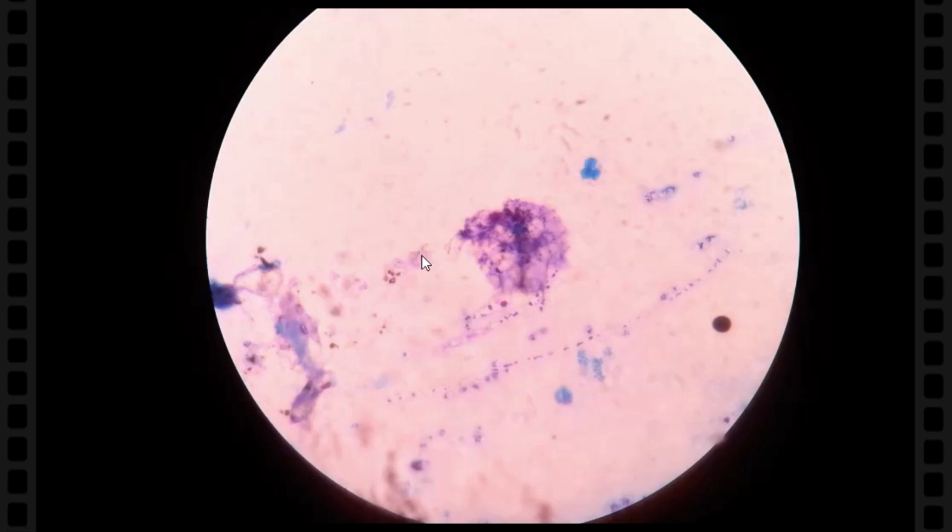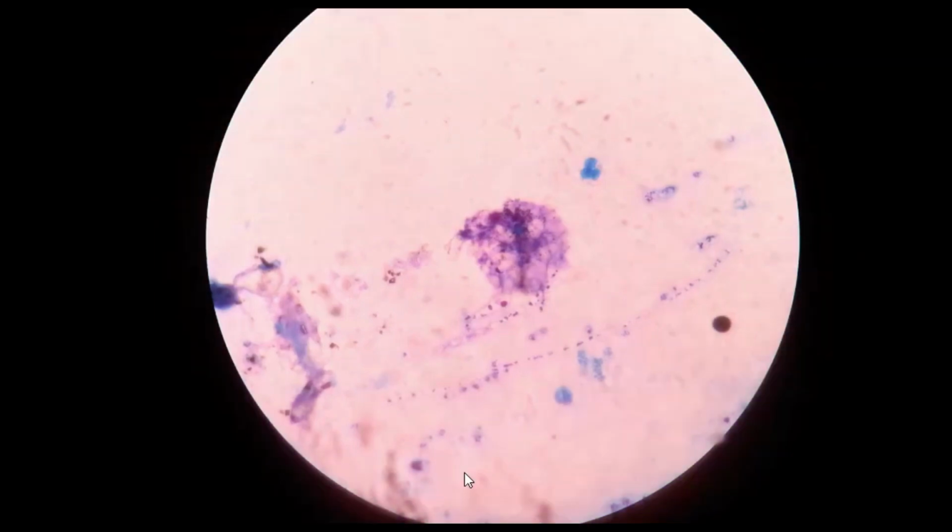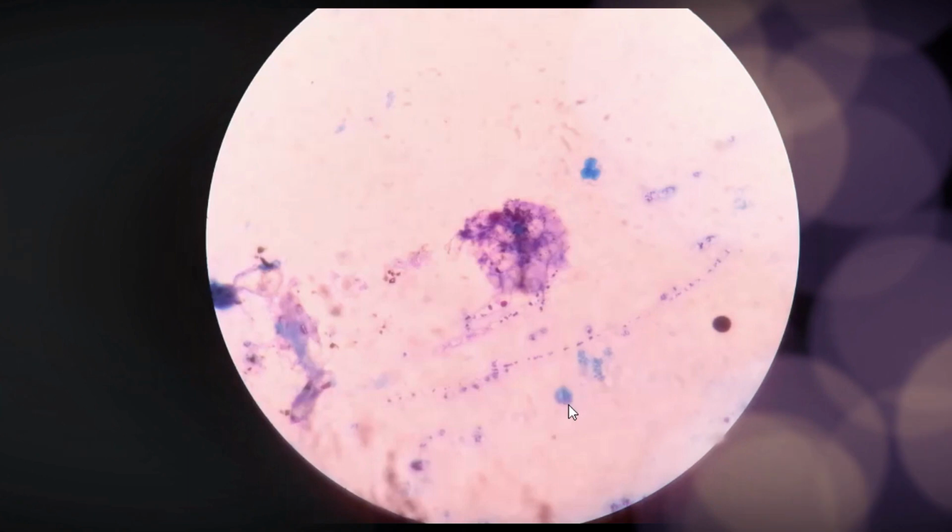Observing the slide for acid fast bacilli, but got Nocardia. What an amazing thing, isn't it? So know a little about this case.